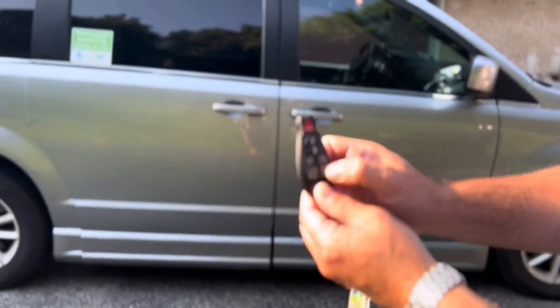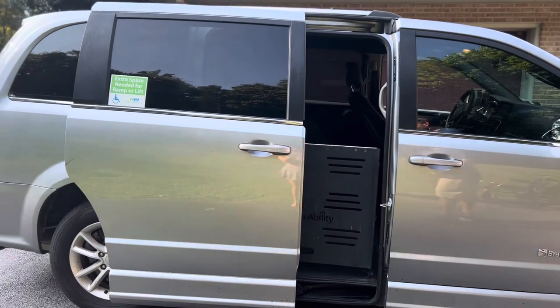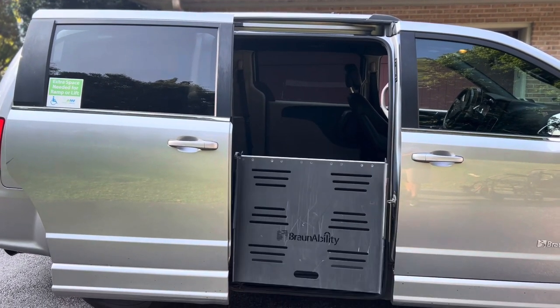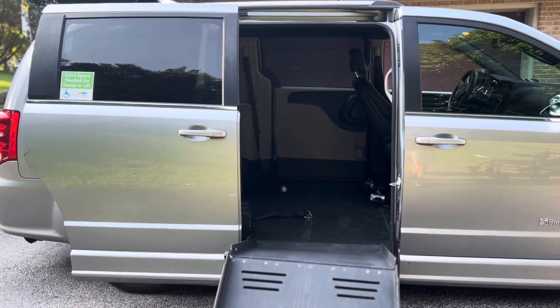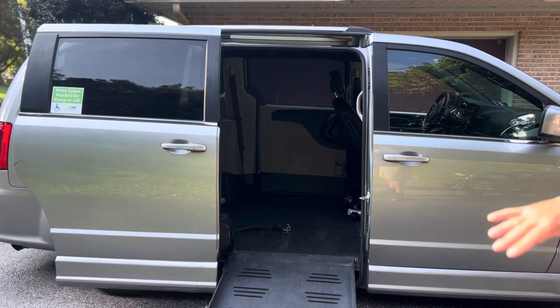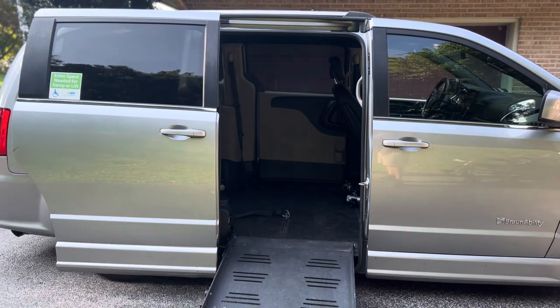So, one, two — you'll see the door opens right up. The ramp will come down, and the vehicle will actually lower so that it makes it easier to get the wheelchair into the van.